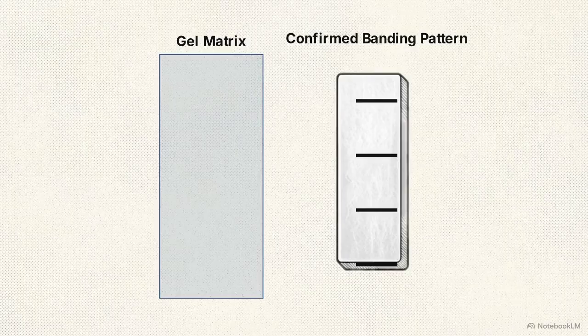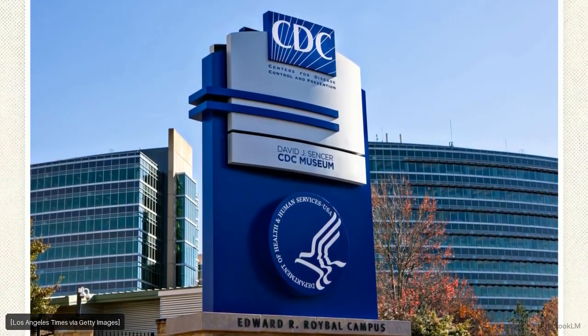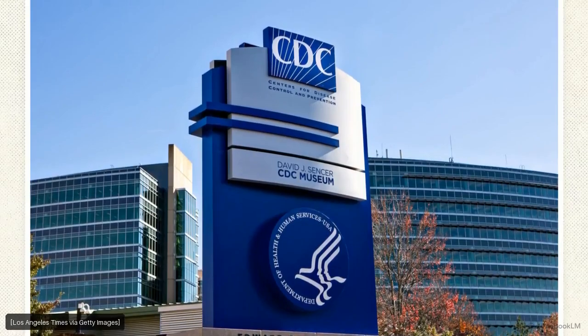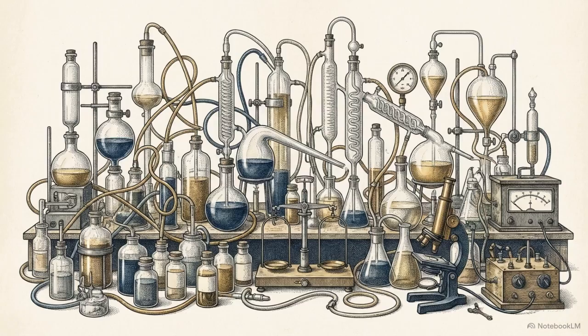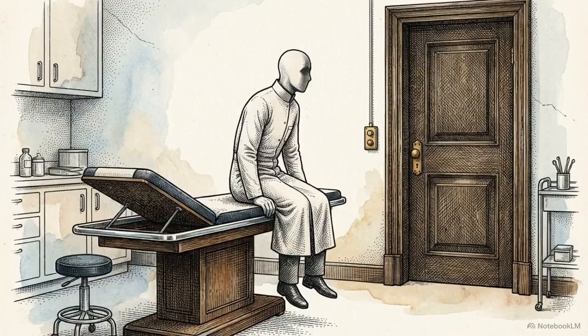However, clinical diagnostic guidelines are actively shifting. Based on modern blood bank data, organizations like the CDC and the World Health Organization are phasing out the Western blot. The test has critical operational flaws. It is highly complex, takes too much time to process, and frequently yields indeterminate, ambiguous results that leave patients without answers.